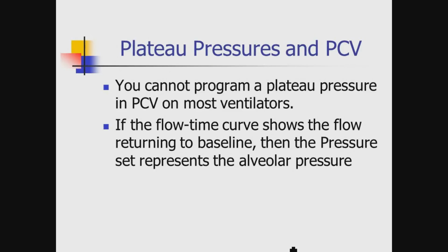Because I'm fixing the pressure, I can't really get a plateau pressure in pressure control by definition. The only time you can is if I'm monitoring my pressure and I'm looking at the inspiratory flow and there's a period where there's a plateau before the beginning of exhalation. That pressure and the volume that is attained can be a surrogate for lung compliance. Okay, and we'll demonstrate that on a couple of the ventilators.